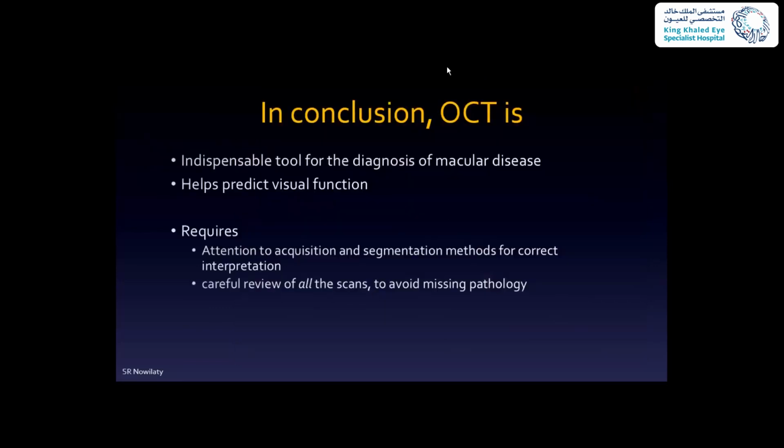Yeah. And so we have a few minutes for questions, but basically, I'm sure you guys know that now this OCT for us is a no-brainer. You need this for the diagnosis of macular diseases. Of course, you have to know that we can do OCTs outside the macula, okay? But of course, it requires a good technique and a very cooperative patient, to center the OCT in the area where you want, to give you more information about the structure.